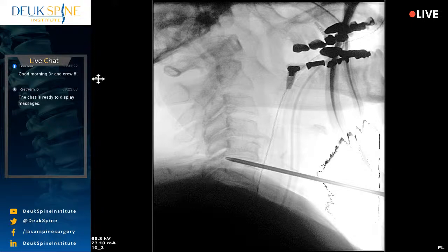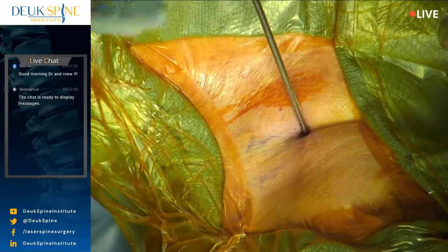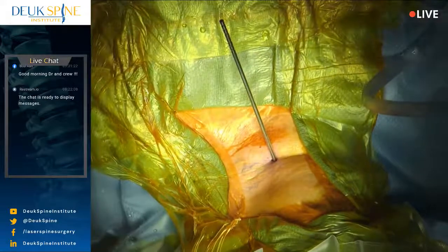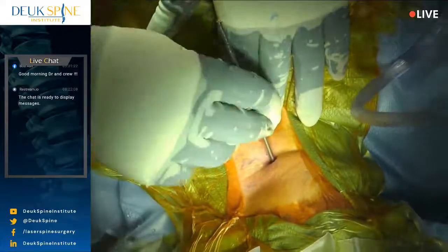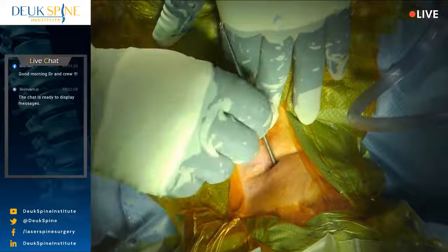I'm going to bring, let me just show you the tube. We're going to do the entire surgery through this tube right here. It's a 4mm tube. So think about ACDF surgery. ACDF surgery, there's a big slit on the neck. Patients have trouble swallowing afterwards. They have hoarseness. Many times it's permanent from the scar tissue and the damage that's done during the surgery by the surgeon.